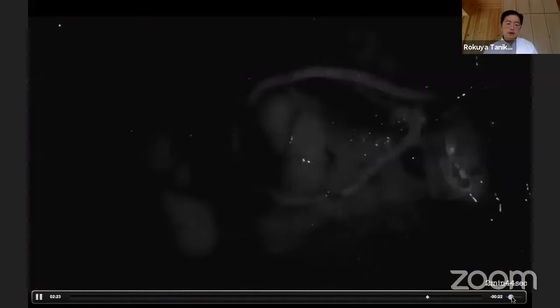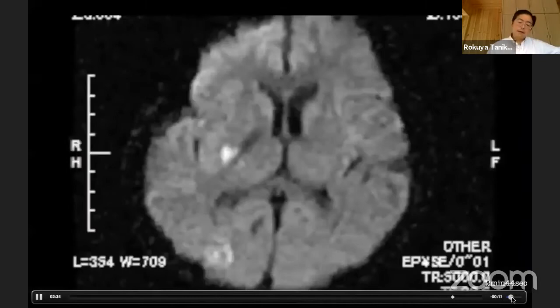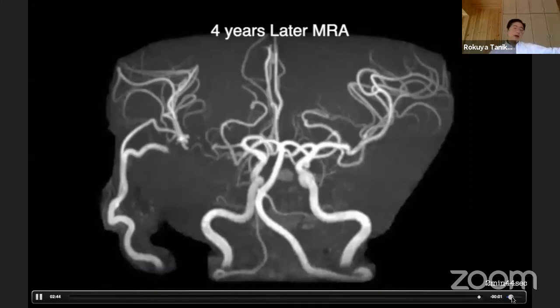One branch of the STA is anastomosed to the superior trunk of M2, and another branch to the inferior trunk. In this case, both branches of M2 are saved by a double-barrel bypass. High signal appeared in the basal ganglia, but the patient recovered. This is a four-year follow-up MRA showing the STA grew bigger and ICA is feeding the PCA and A1.